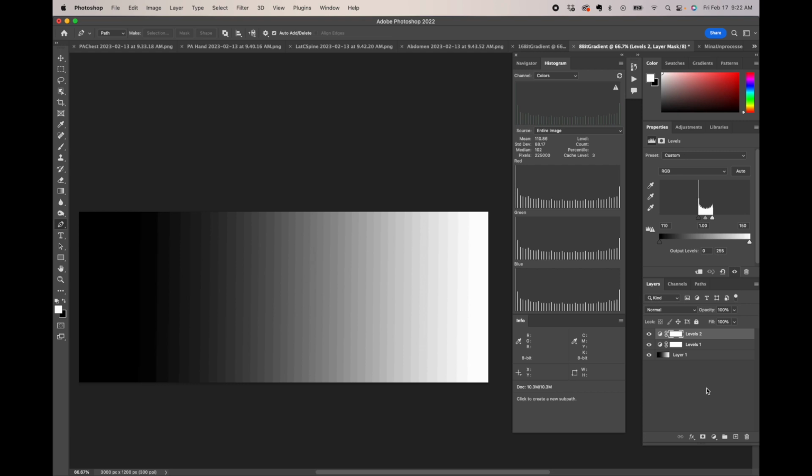particularly when it comes to working with video. This may not factor in so much when it comes to the static images that we have with X-ray, but just think for a second about CT scans and MRI, where you're having hundreds or thousands, I'm not certain exactly, of cross-sectional images created by the machine. Then they have to be put together in the computer to render this image and make it so you can just scan through the body like you can with MRI or CT.